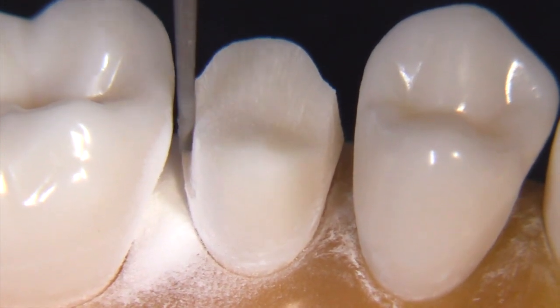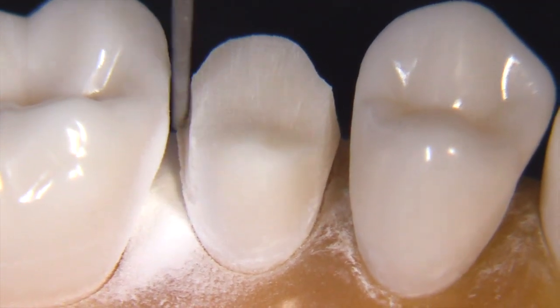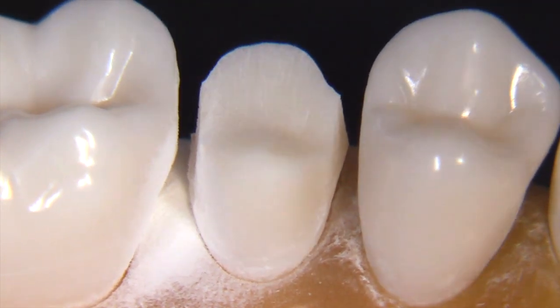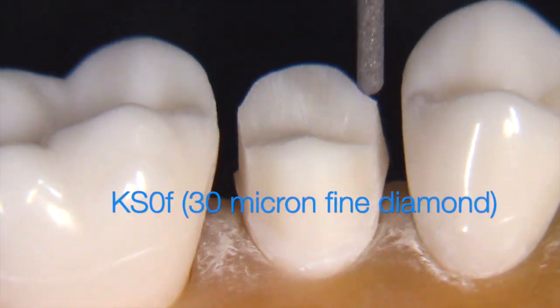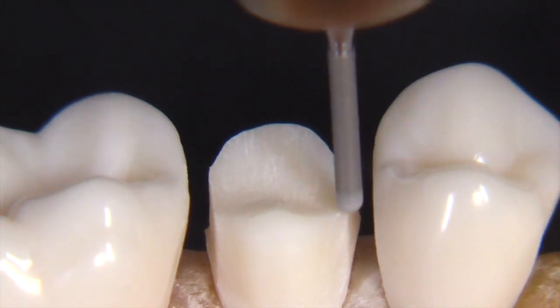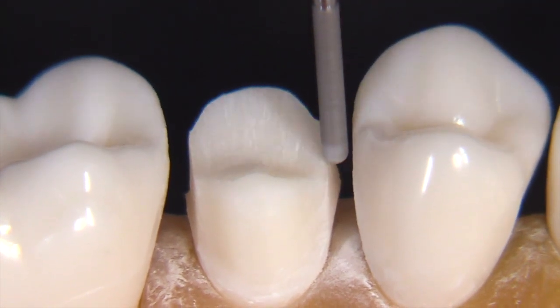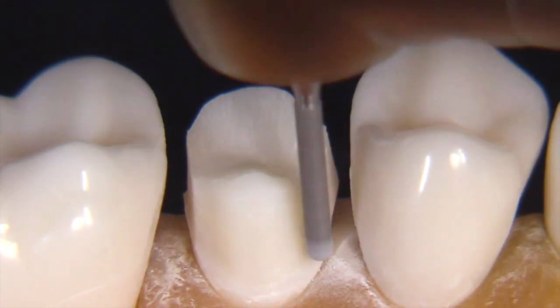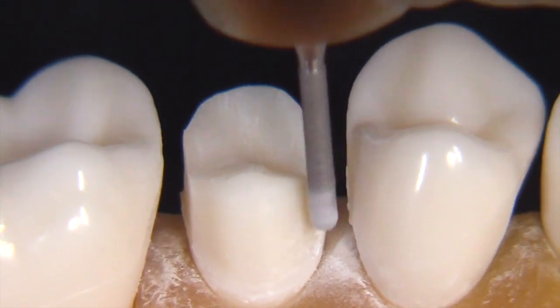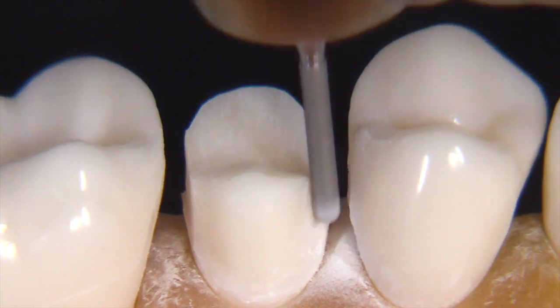We're not worried so much about the finish line shape at this point — we're mainly concerned about breaking through the interproximal. Now let's switch over to the KS0F. This is the same as the KS0 except for two things: it's a little longer, and it's got a 30 micron grit diamond particle. You can recognize this burr easily because of the red stripe at the shank. Otherwise it's the same shape and dimensions in terms of width. Be really careful not to hit the premolar as you're going through the interproximal.